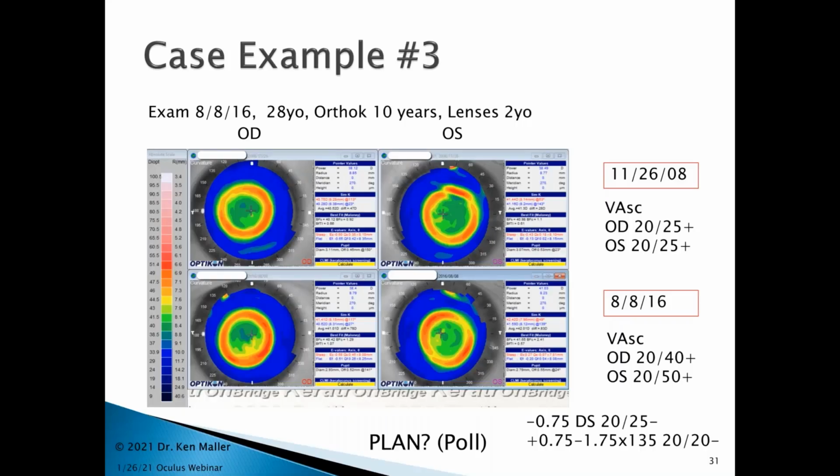All right, so looking at the results of what you said out there, 2/3 of you would just replace the lens with a duplicate pair. 11% said that we should go ahead and change the lens design because we do have that refractive error there. So we probably need to alter it a little bit to address the change in the apparent prescription, blowing off the fact that it's 2 years old and maybe that might be artifactual. Maybe it's actually a real change.